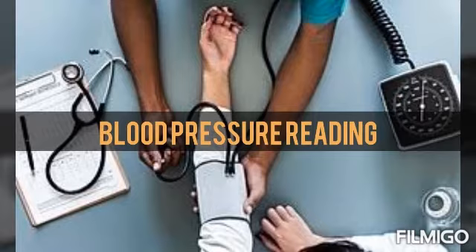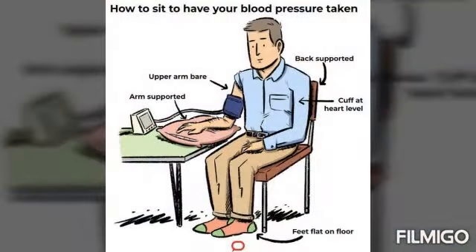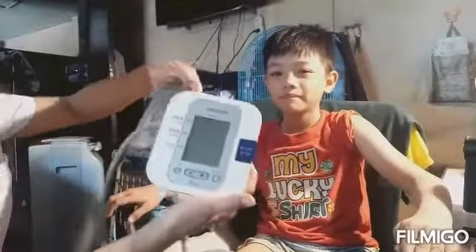Let's read Nathaniel's blood pressure. But first of all, let's learn how to sit when your blood pressure is taken. Number 1, you must not have conversation. Number 2, put cuff on bare arm.